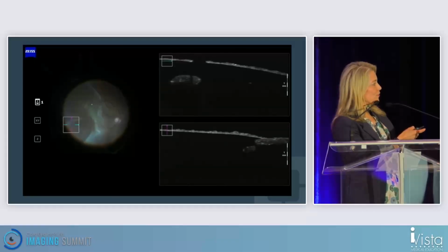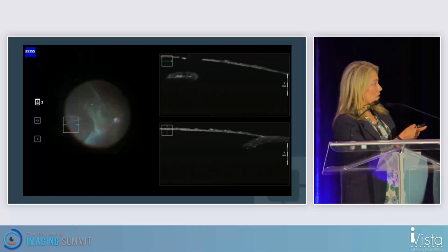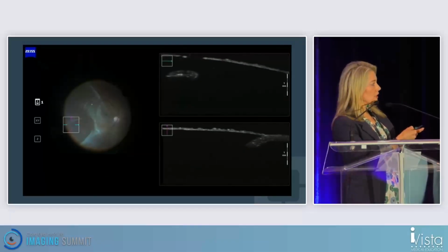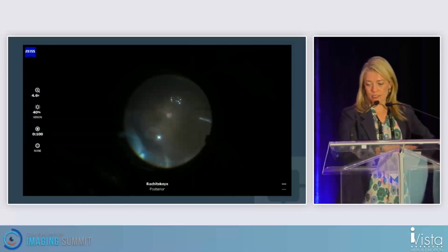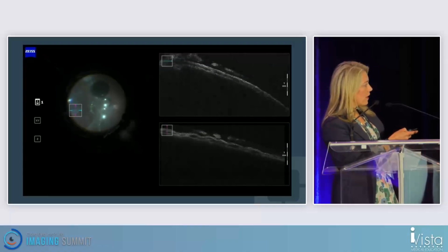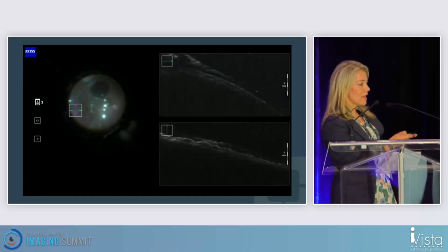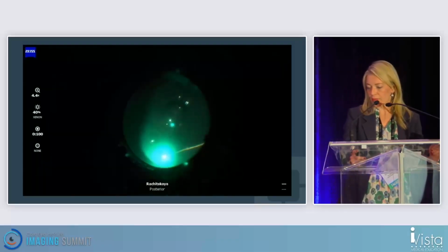And you can see this beautiful edge of the outer retinal defect. And you can see the communication between the cavities, which caused the problem in the first place. And you really need to collapse both of these cavities to treat this patient. We mark it, and then we can confirm under PFO that we collapse, in fact, both cavities, and we can see our markings with diathermy.